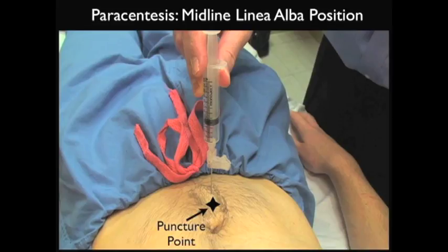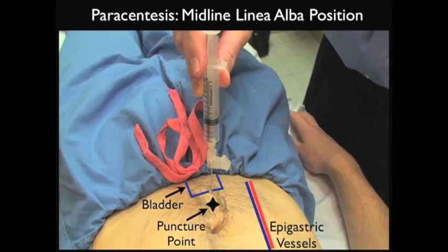Note here, we'll be coming through the relatively avascular midline linea alba. But recall that it's very, very important from this position to not puncture through the bladder, and we can see the relative location of the bladder in relation to the puncture point. So we must have the patient void or place a Foley catheter prior to attempting a paracentesis from the midline linea alba position. Note again here the location of the epigastric vessels lateral to the midline linea alba, and we can see here that a puncture point from the midline linea alba approach would safely avoid puncture through the epigastric vessels and avoid any unnecessary bleeding through the abdominal wall.